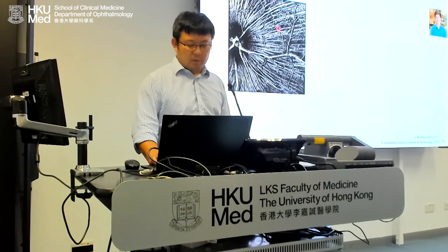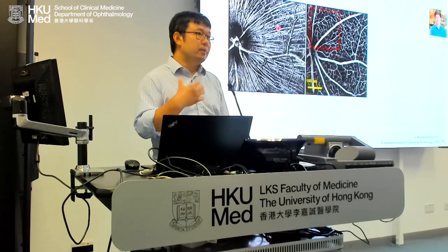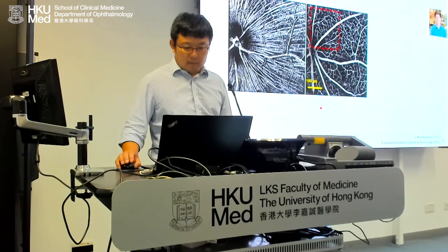In this case, the fiber bundles and the vessels are mixed. There's no way to separate them. And now we have to do an OCTA protocol. Now the fibers are gone, right? They're all from the same data set. One processing of both vessels and fibers, a second processing of only vessels, and then combine them. There is a very good visualization of bundles and vessels.